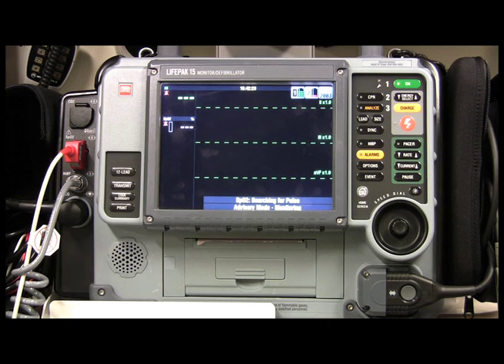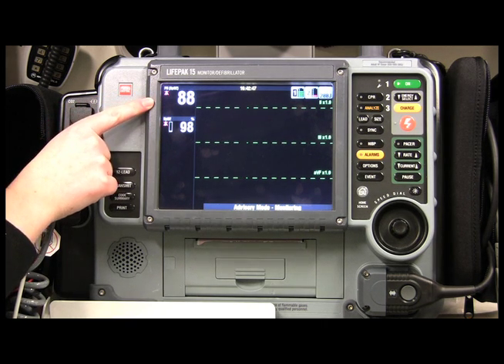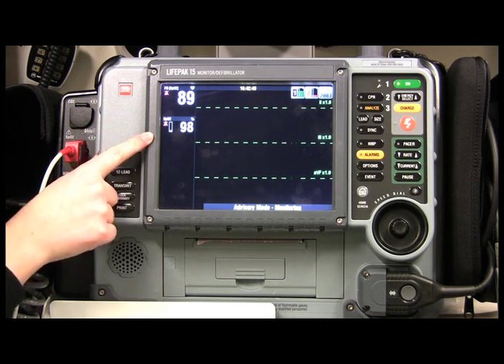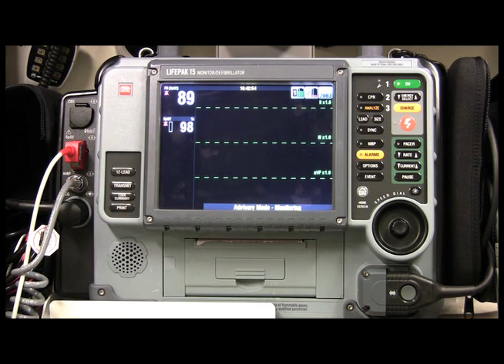Remember, pulse oximetry doesn't work well with nail polish, long nails, or cold hands and fingers. You can also get abnormally high readings with a patient who has carbon monoxide poisoning — the reading will be falsely high. As you can see, my heart rate is a little high at 88 and my SpO2 is at 98%, so those aren't bad readings.